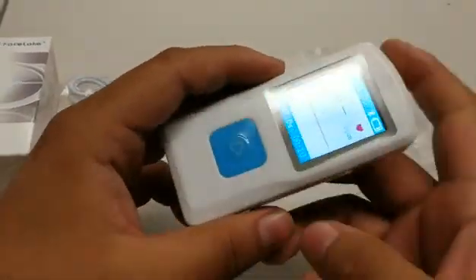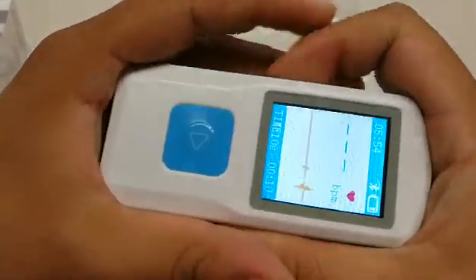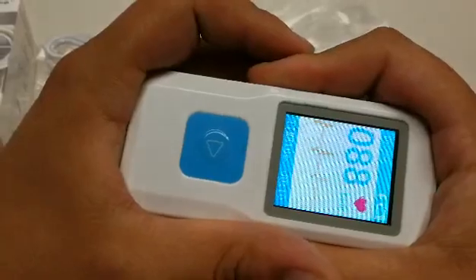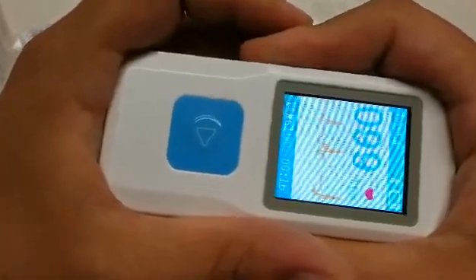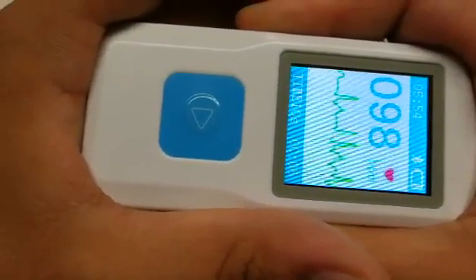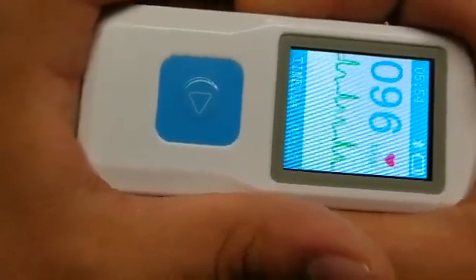Please hold the item in the first mode, remembering to cover the metal leads. This will initiate a waveform as well as beats per minute that, when going from orange to green, will start the 10-second timer and will give you a reading.